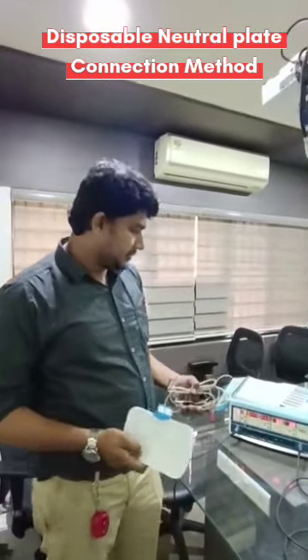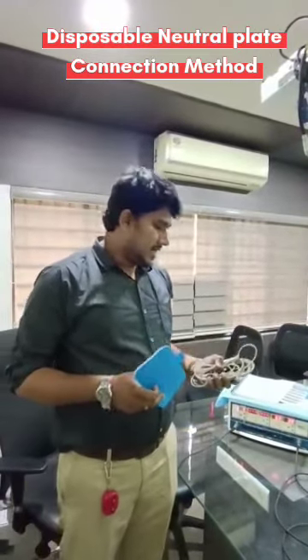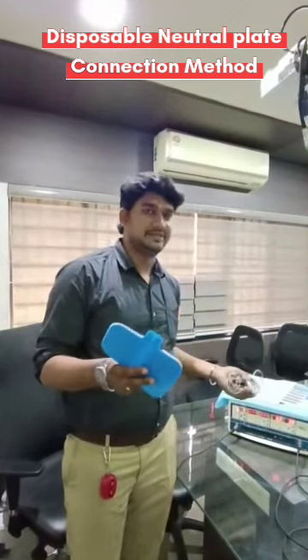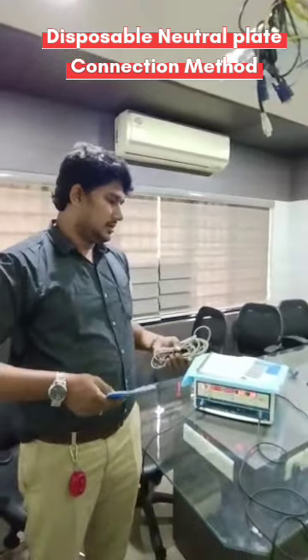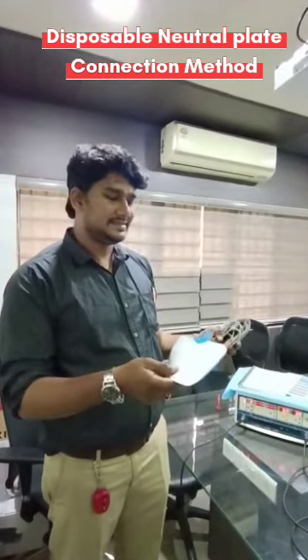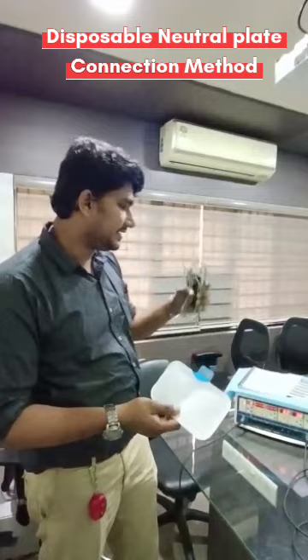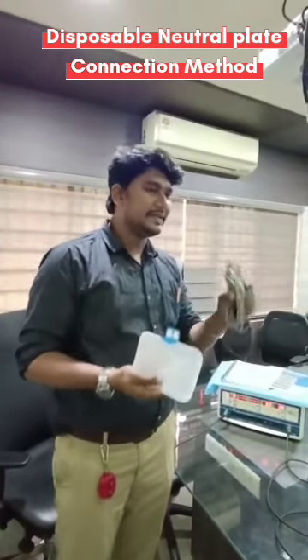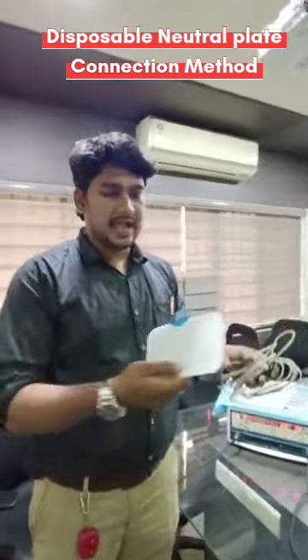Good evening. Today I'm going to demonstrate how to fix this disposable neutral plate with the machine. Several technicians know about how to connect and all, but this is a separate plate which has come up with a different separate cable — the plate will be separate.